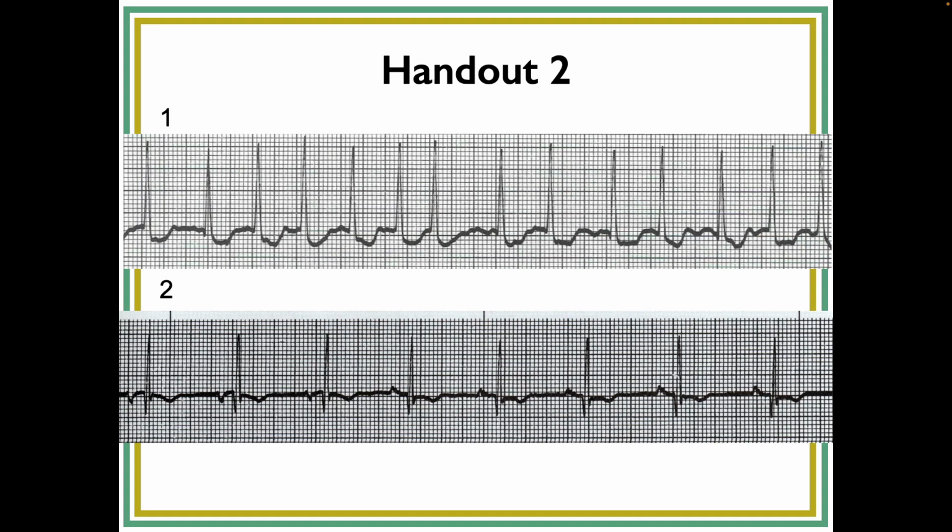So this is AFib. It's about 3 boxes. Okay, so AFib. This is AFib, okay? So when you get to irregularly irregular with no P waves, you're almost home free right there. Okay, Grace, next one, please.